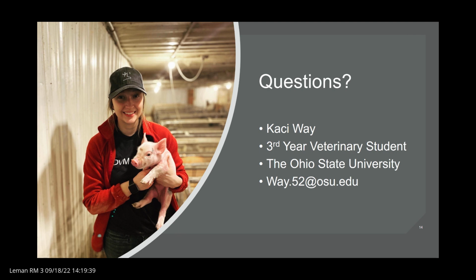Great job, Kaci. One question is, did you look at multiple people taking those temperatures and if there were differences between the person taking that temp and the infrared reading? So that's a really good question. She asked if I looked at different people taking those temperatures and seeing if there's differences in readings. For this study, I did not. I'm the only one that took temperatures just because I wanted to keep that consistent throughout this study. But I think that's a good thing to look at in the future.